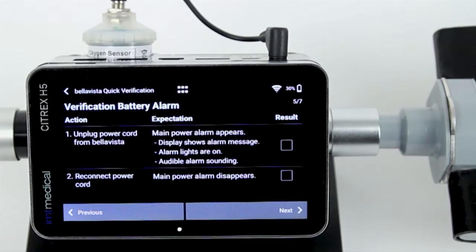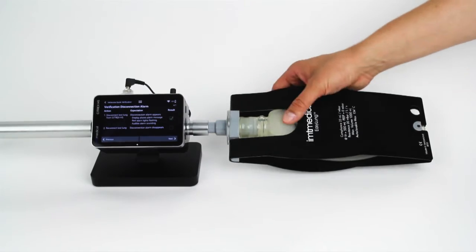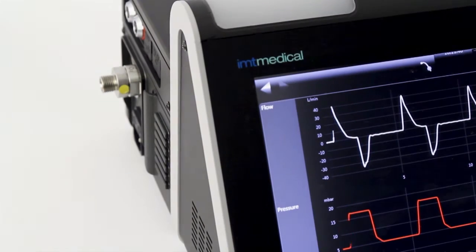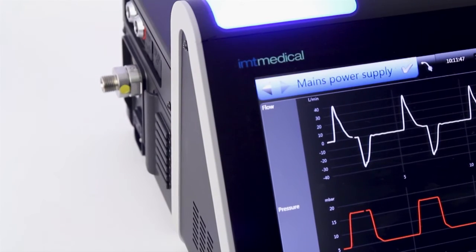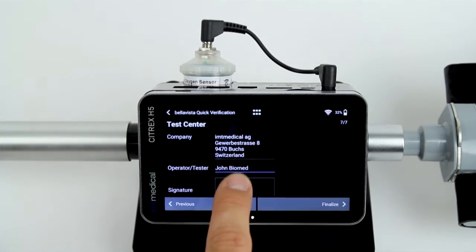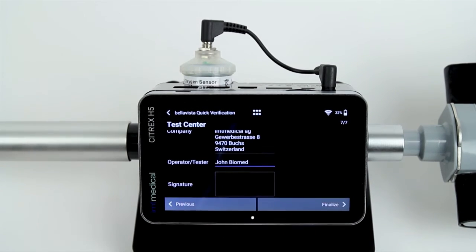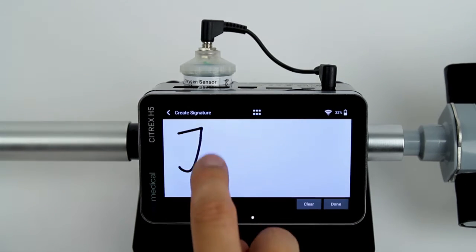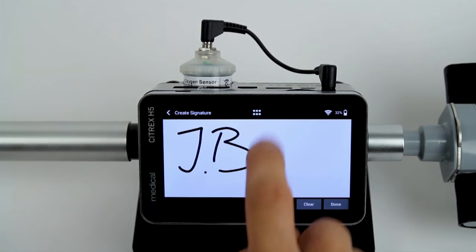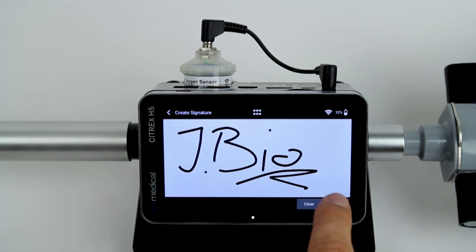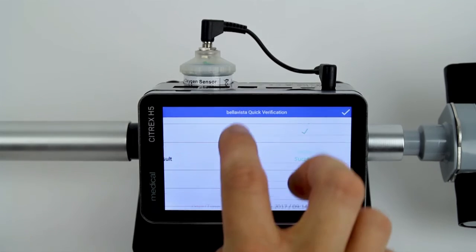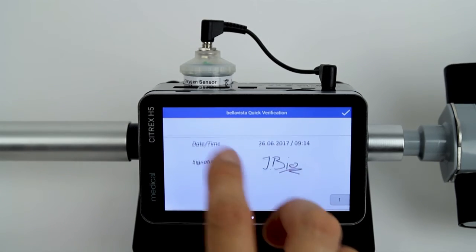On the next two steps, the app guides you on how to check the alarm and power supply system — very easy as well. At the end, you can enter your information and sign directly on the CITREX display. The app generates a PDF report, stores it, and makes it available on the cloud.